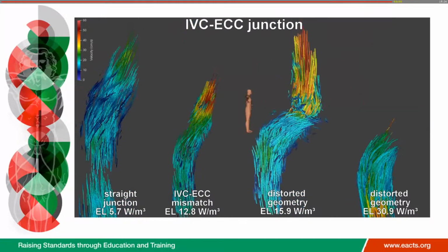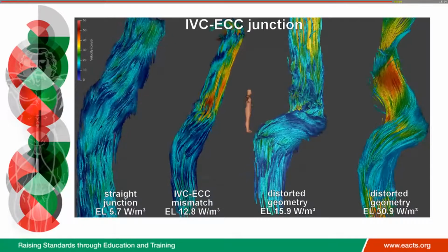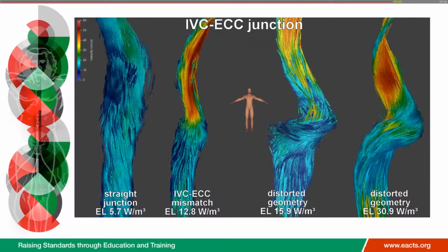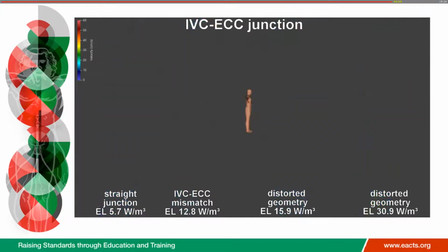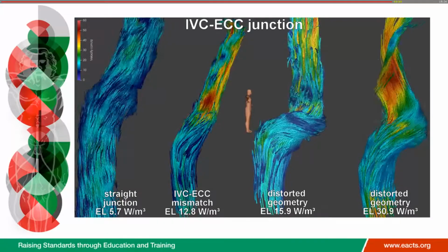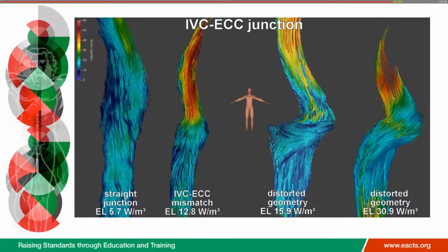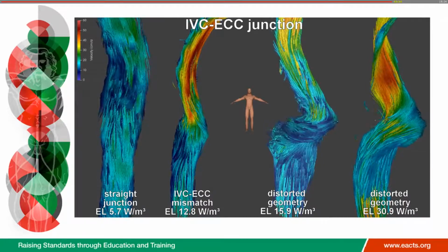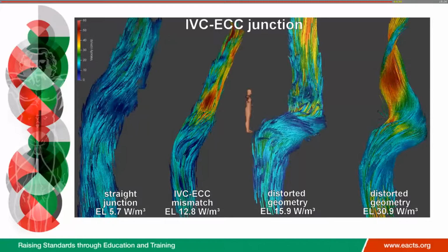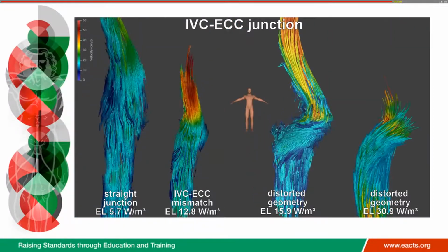And also there's penetration of SVC flow into the body of the conduit, and disturbed flow in the lateral portion of the conduit. And this is in the clinically important range, somewhere between 2-to-1 and 1-to-1 mismatch. And in clinical practice with a 20 or 22 millimeter conduit, depending on the age of the Fontan and so on, it's actually more likely that you'll have a mismatch in the opposite direction. That is, the conduit will be bigger than the IVC.